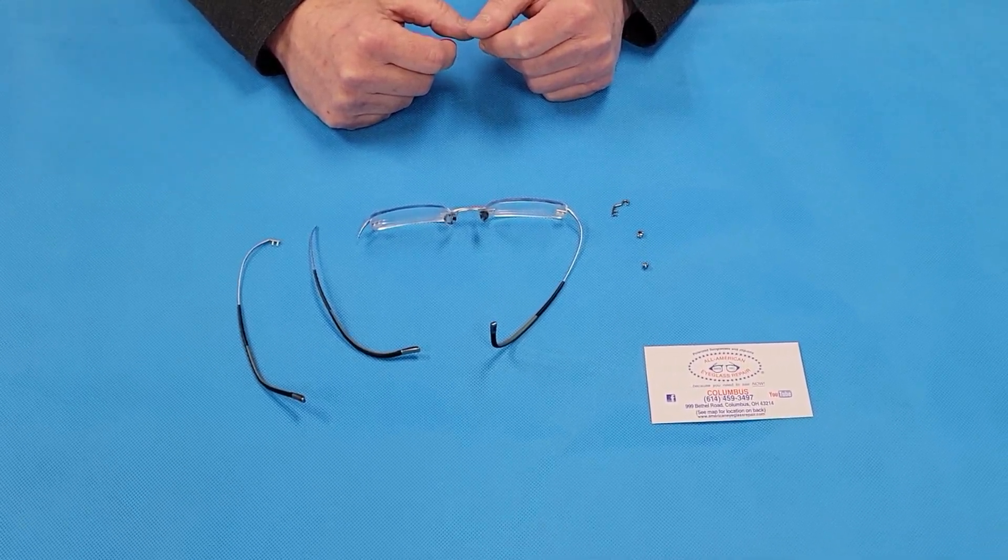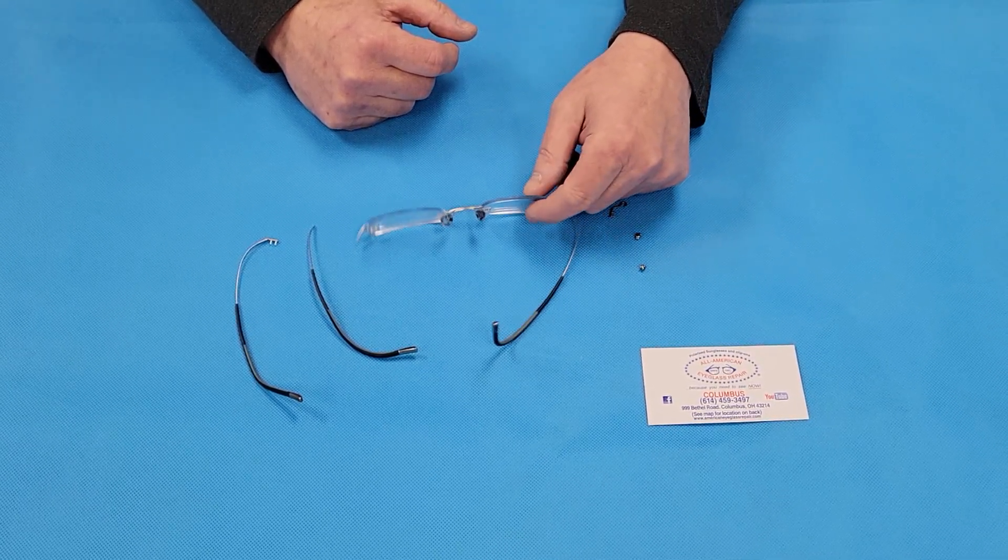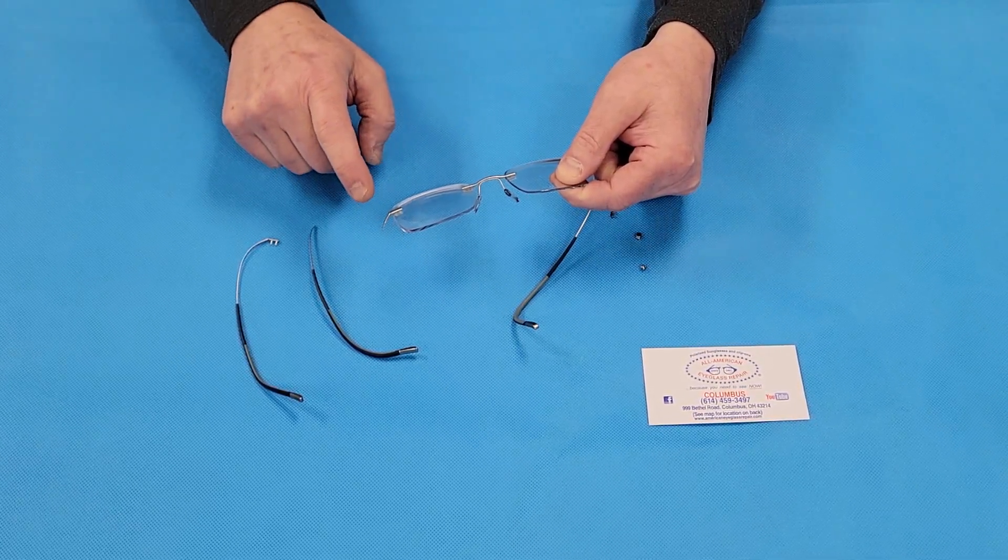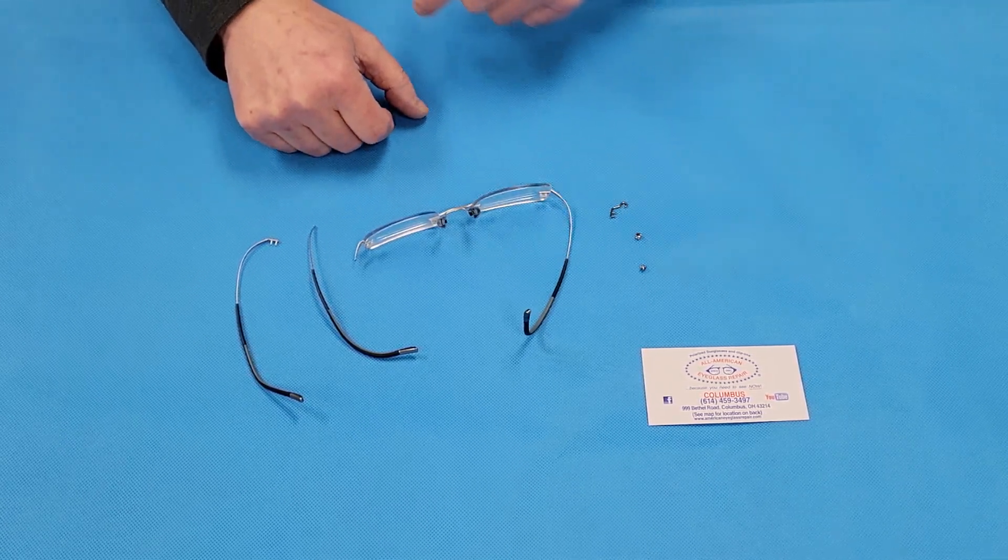Hi, this is Rick with All American Eyeglass Repair and I want to talk about Silhouette Eyeglasses. The Silhouette Eyeglasses, these are the three-piece drill mounts. You'll notice there's one, two, three pieces that are drilled in, and the metal pieces go into the lens there.